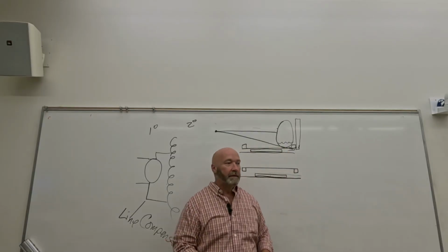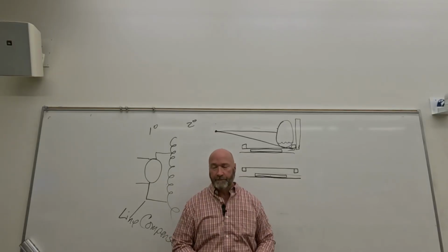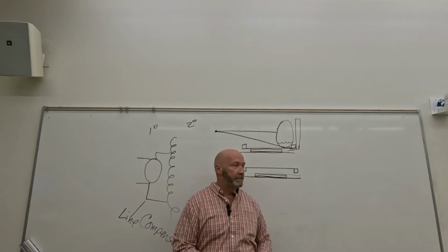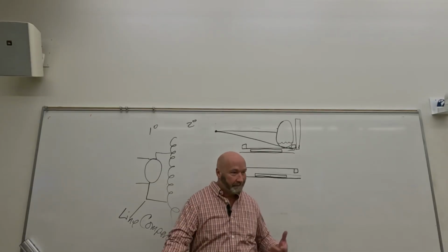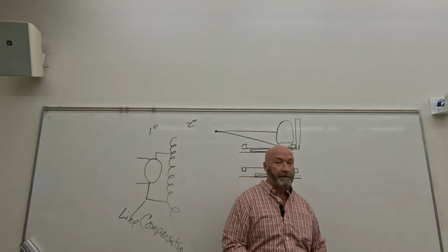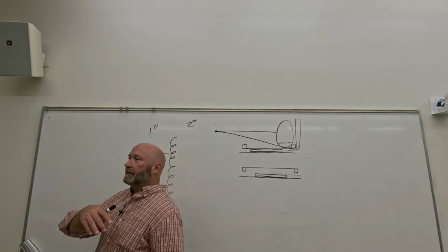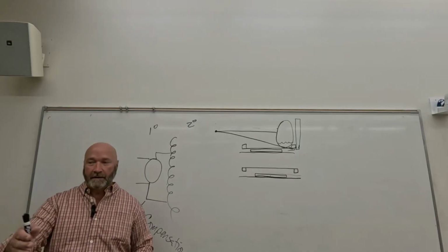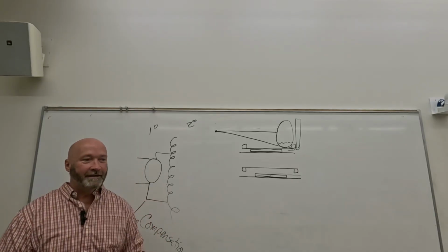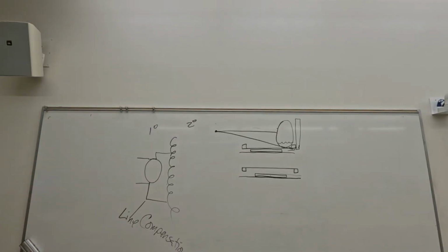Because once the patient gets on it, if they step on it and then it slips, these are older patients most of the time, they can very well hurt themselves, right? It's like stepping off the curb. That's where we get a lot of our hip fractures, older patients stepping off the curb. So even if it's already on there, and even if it's already stood up, you get on it, stomp on it, and make sure it's not going to slide. So anyway, that's just your public service now for today. Don't hurt your patient with the footboard.